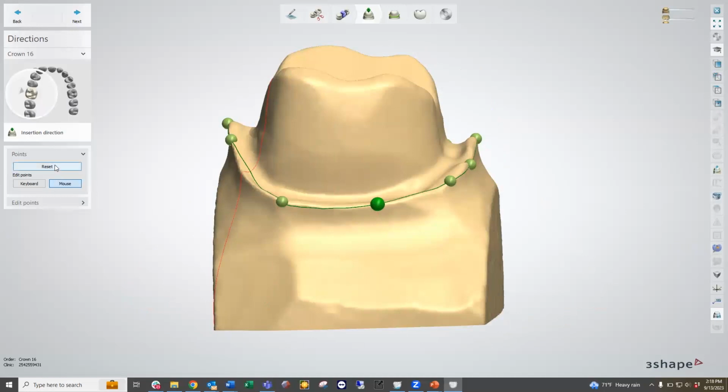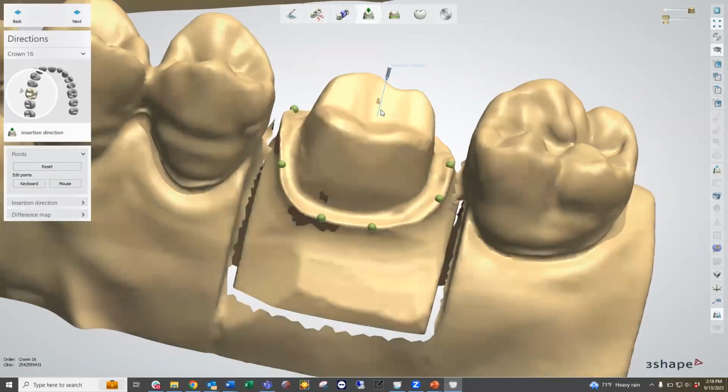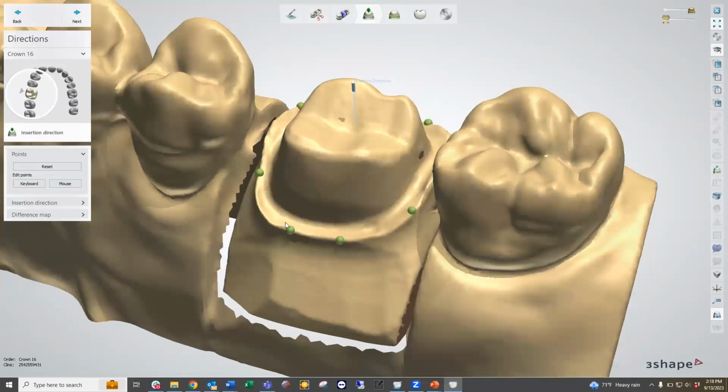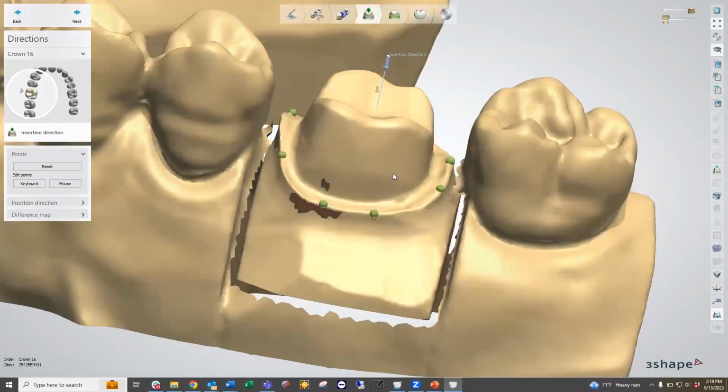All right. So I'm just going to go ahead and hit reset. But this basically allows us to see that idealized path of insertion based upon where those green dots are sitting. If the green dot, for whatever reason, was sitting inside here, then you would want to change that to help you with an idealized path of insertion.